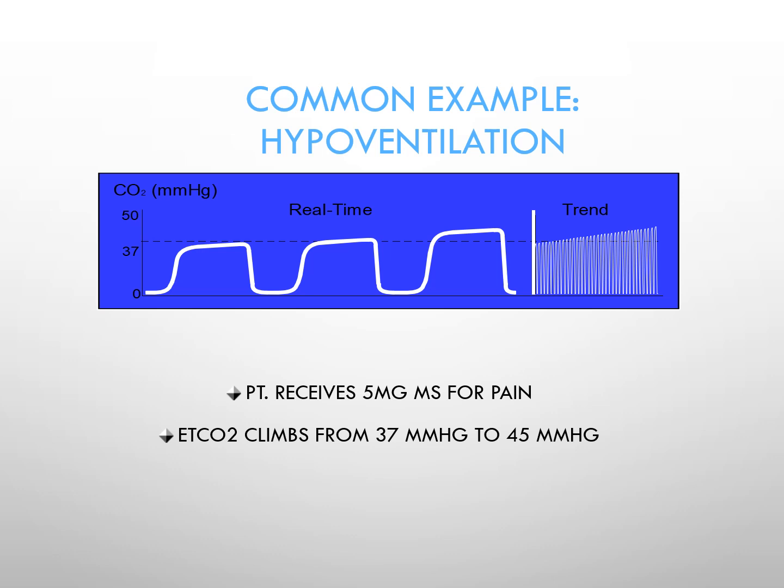One of the newer indications, and it really is the standard of care, is when a patient is receiving moderate sedation for things like bronchoscopy, endoscopy, colonoscopy, and other procedures. We used to call it conscious sedation; now we call it moderate sedation. The standard of care is pretty much to measure end-tidal capnography to help ensure that we're not significantly depressing their respiratory drive.